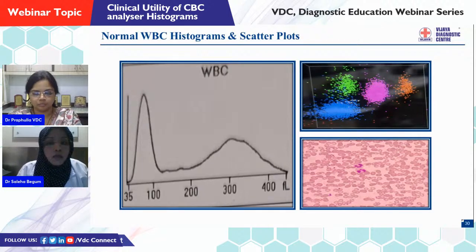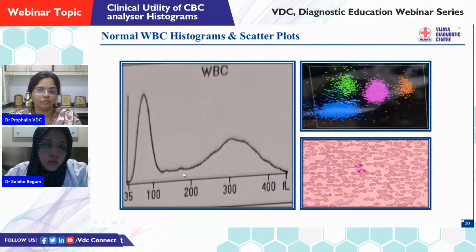This is a normal WBC histogram and scatter plot. Let us interpret this. This graph is showing two curves and a slight middle bulge. This extreme left curve is giving us information about the small cells, which we have seen. It is nothing but lymphocytes, and the mid cell data between 100 to 200, and then the neutrophils. That is exactly getting correlated with the scatter plot.